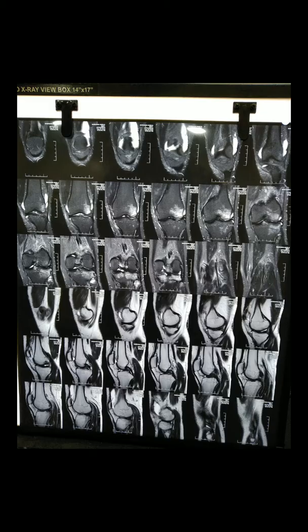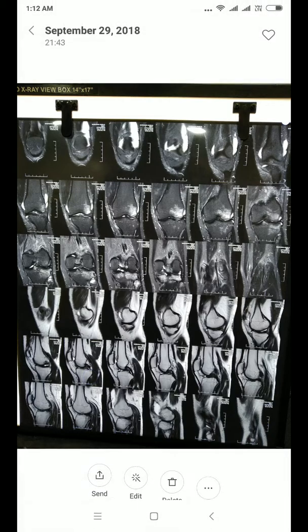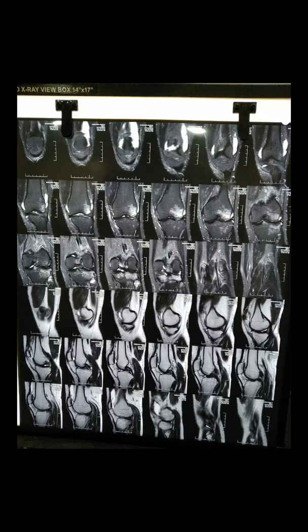He said, okay doctor, we will discuss with our family and we will come. He underwent MRI of the knee. So let us read this MRI of the knee from the orthopedic surgeon's point of view. Once again, I am telling - we are not radiologists, we are orthopedic surgeons. For us, clinical examination is very, very important.